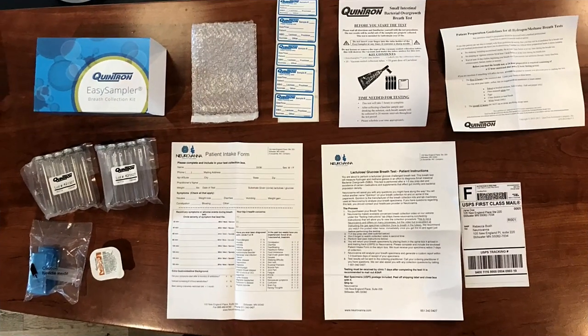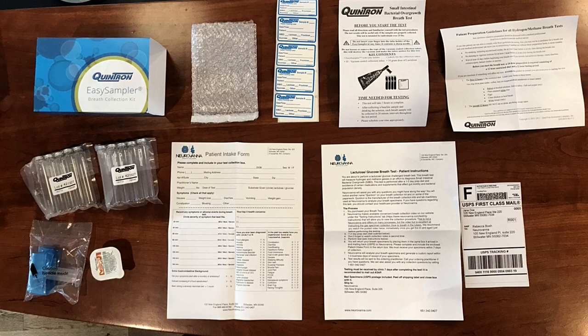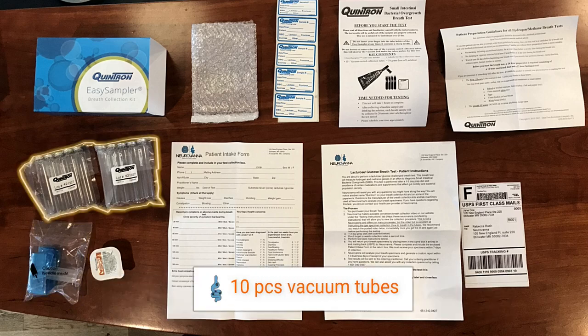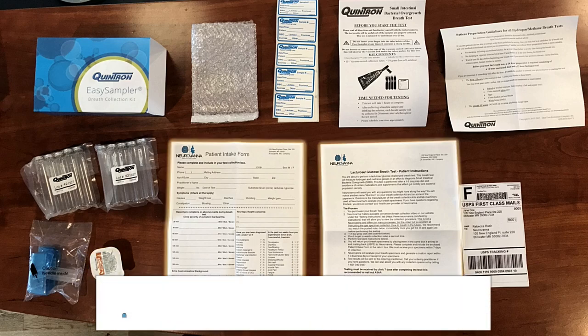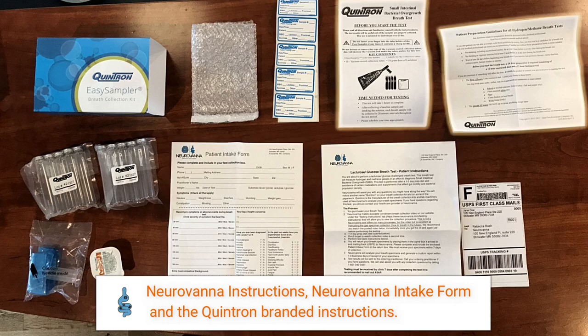Neurovana uses only Quintron-supplied collection materials, which ensures the best and most reproducible test results possible. Each Neurovana-supplied kit contains Quintron's Easy Sampler with tube holder, 10 vacuum-sealed collection tubes, labels for the collection tubes, lactulose or glucose sugar substrates, the Neurovana Instruction Intake Form, and the collection instructions.